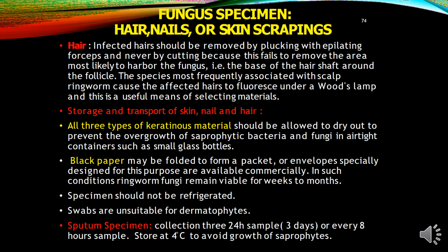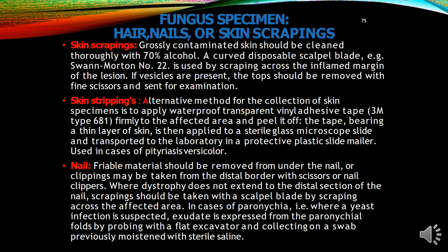Sputum collection for fungus: you have to collect 3 samples over 3 days, or 8-hourly samples for 3 days. Storage at 4 degrees Celsius. Skin scrapings: grossly contaminated skin should be cleaned thoroughly with 70% alcohol.